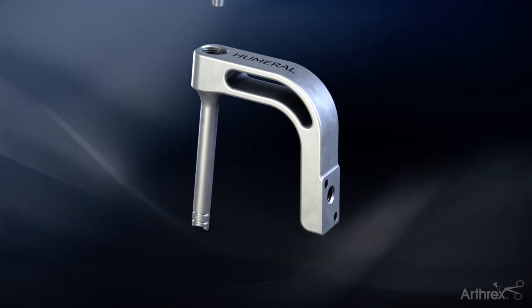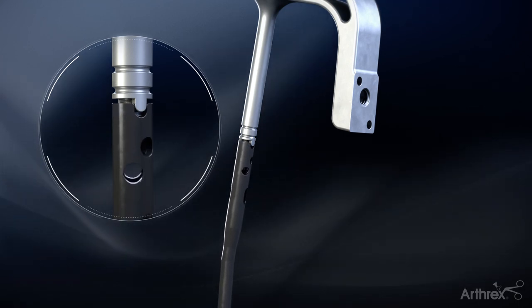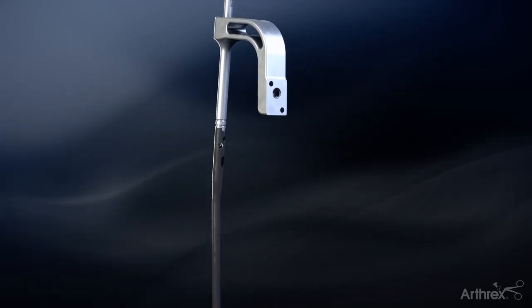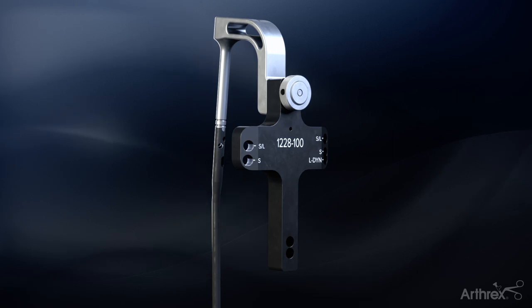Attach the nail to the targeting arm by inserting the holding bolt and aligning notches at the top of the nail and the connection point to the targeting arm. Tighten the holding bolt using the 5.0mm hex driver until the nail is securely fastened. The curvature of the nail should go towards the targeting arm once attached. Tighten the targeting jig onto the targeting arm by spinning the thumb wheel until tight.